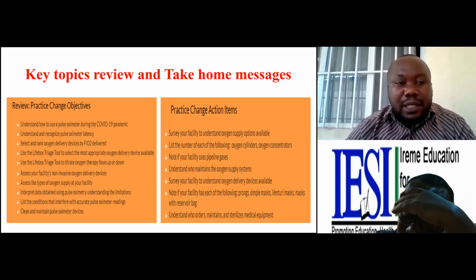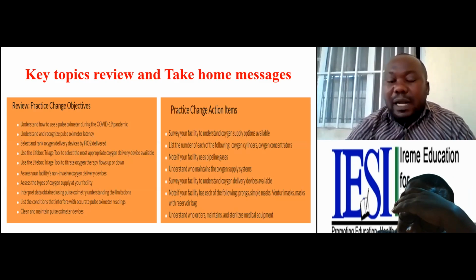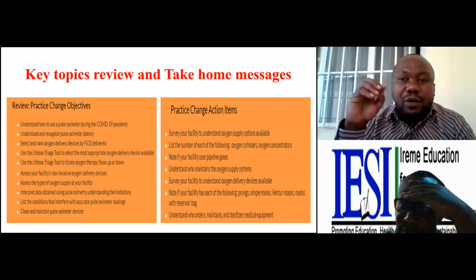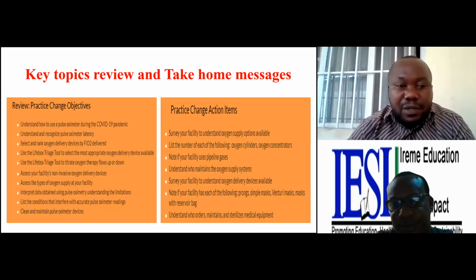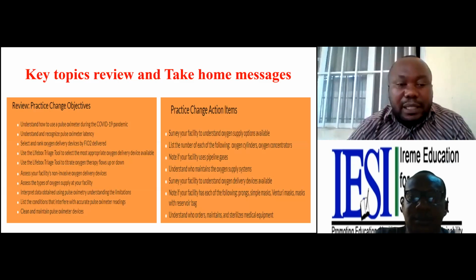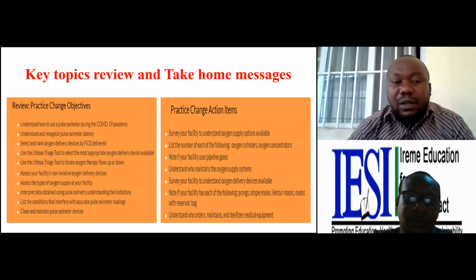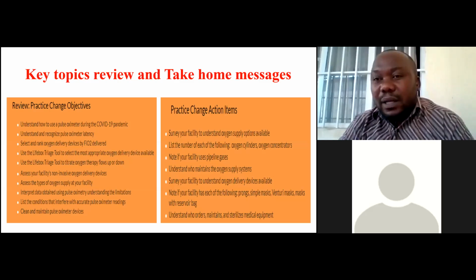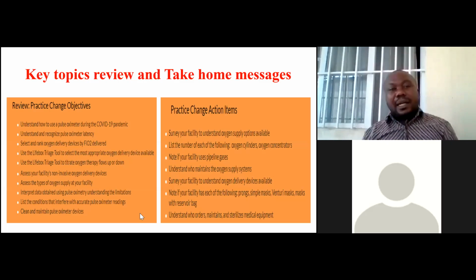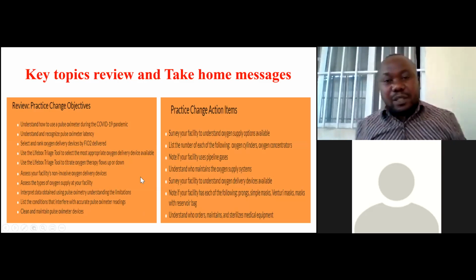Be able to use the LifeBox triage tool, as you see, by considering the symptoms and the emergent signs. You may know which kind of devices you can use in escalating that, and also know how to clean the pulse oximeter. And by now, our assignment is to assess in our facility the oxygen delivery devices we have, and the source of oxygen we are delivering to the patients we are treating. That is our take-home message from this talk.